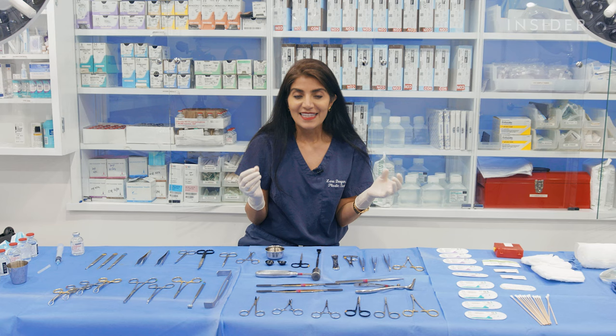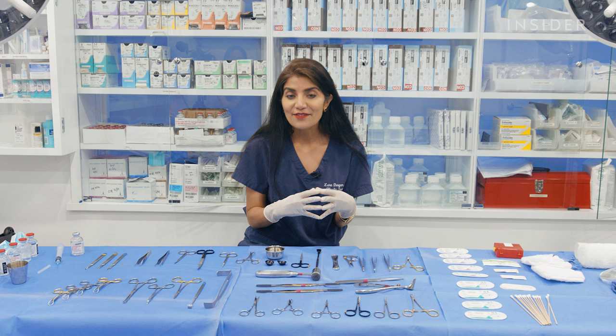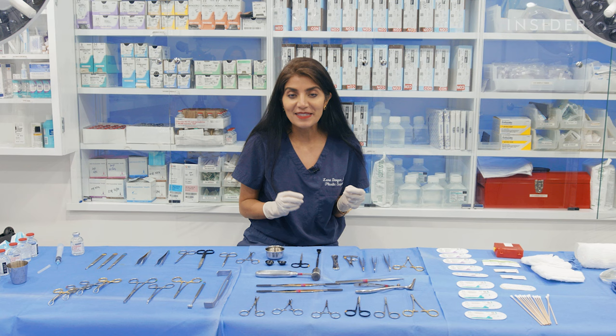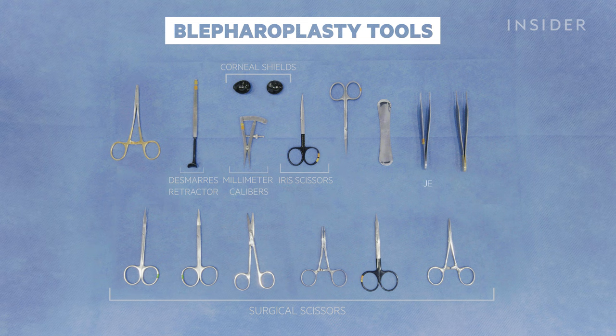The skin around the eyes is the thinnest and finest on the body, and for that reason, the instruments that we use to close the tissues around the eyes are also some of the very finest that we use. And I love these instruments because they're so tiny and adorable. These are jeweler's forceps, and these are very fine needle drivers, and they're both very tiny in caliber.